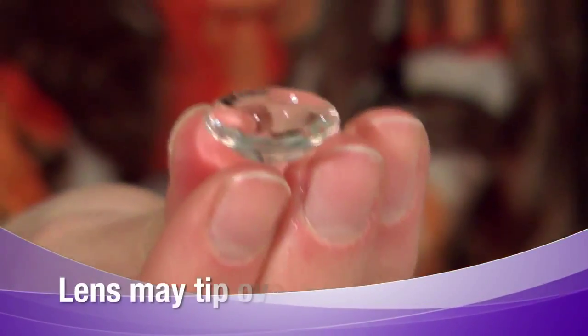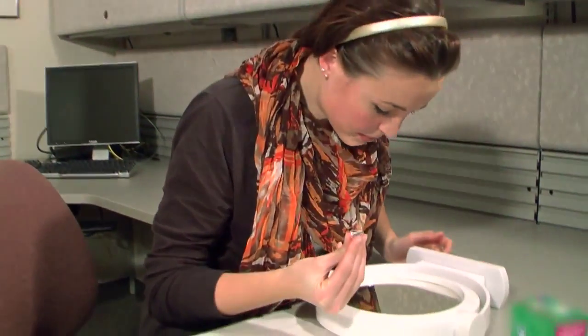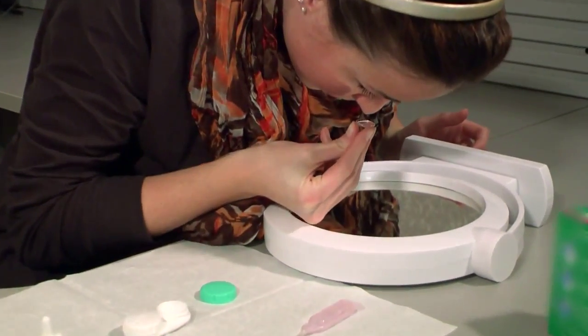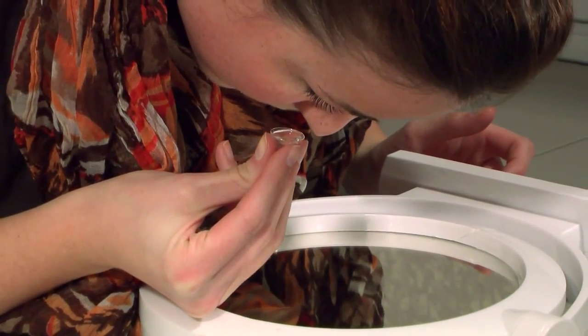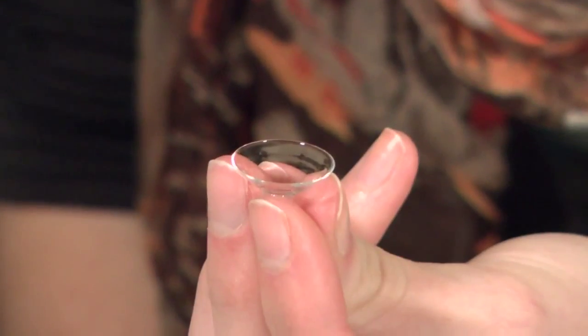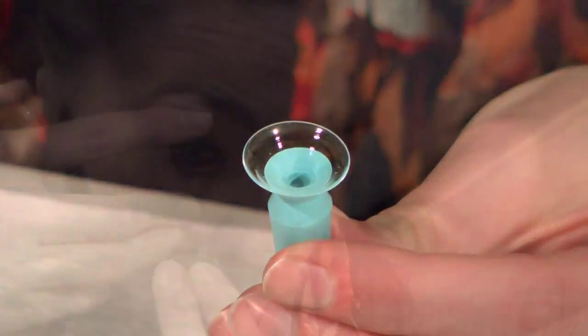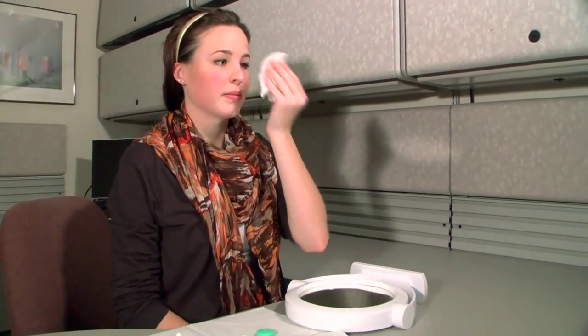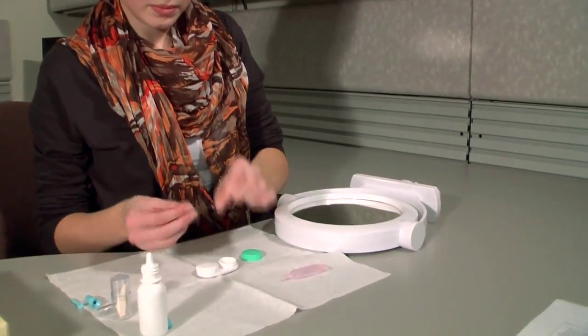When the bowl is filled with saline, it becomes much more prone to tipping over and falling off the finger. To insert the lens, your face must be parallel to the floor with the eye looking at the floor so the fluid will stay in the lens bowl. It may be helpful to place a fixation dot on a mirror lying flat on the table. Wet eyelids are difficult to hang on to, so make sure both the lids and your fingers are dry before you begin.